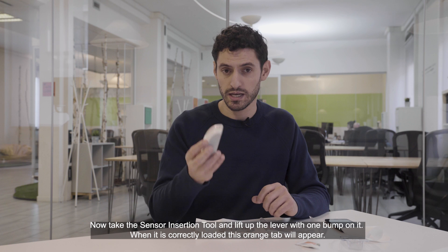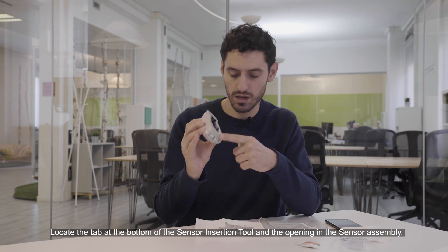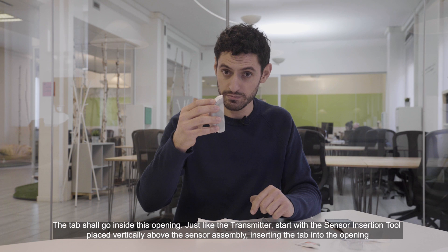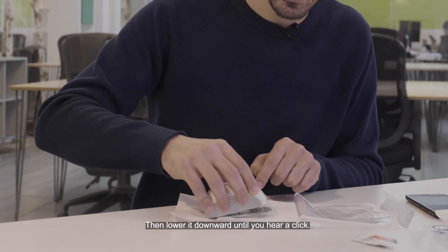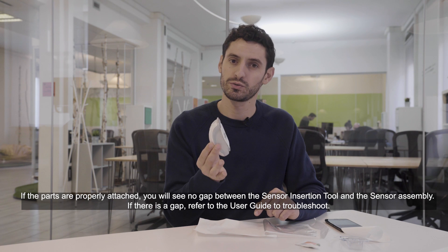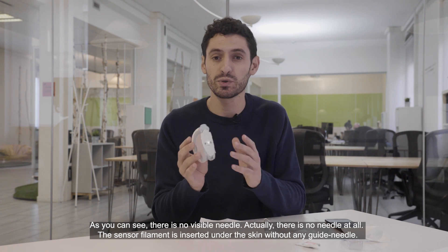Now take the sensor insertion tool and lift up the lever with one bump on it. When it's correctly loaded, this orange tab will appear. Locate the tab at the bottom of the sensor insertion tool and the opening in the sensor assembly — the tab shall go inside this opening. Just like the transmitter, start with the sensor insertion tool placed vertically above the sensor assembly, inserting the tab into the opening, and then lower it downward until you hear a click. If the parts are properly attached, you will see no gap between the sensor insertion tool and the sensor assembly. If there is a gap, refer to the user guide to troubleshoot. Note that there is no visible needle — in fact, there is no needle at all. The sensor filament is inserted under the skin without any guide needle.